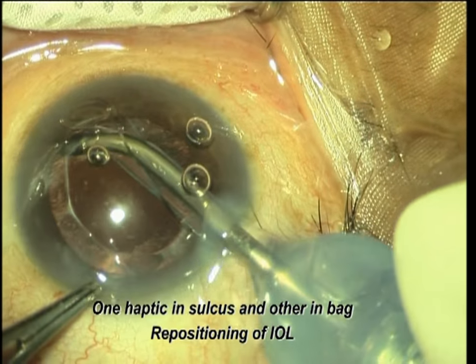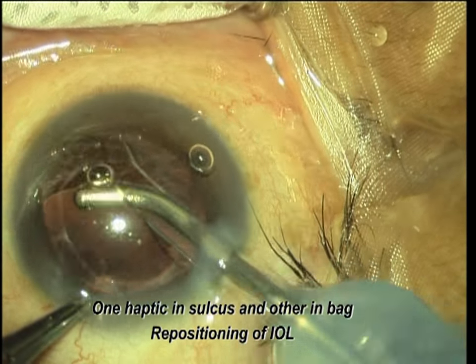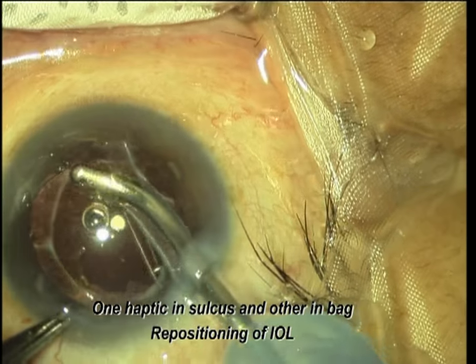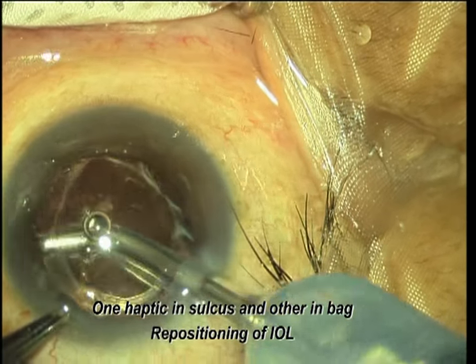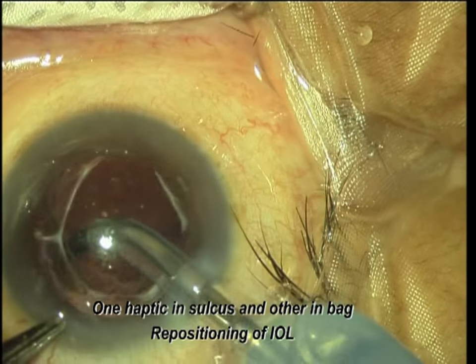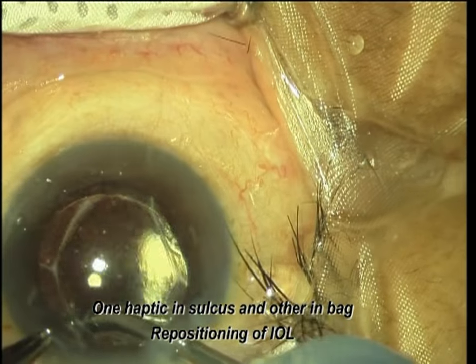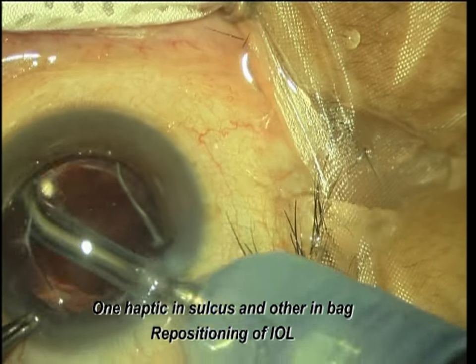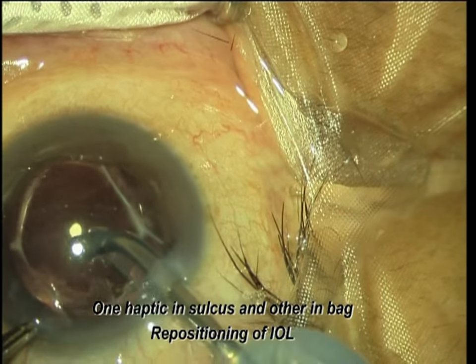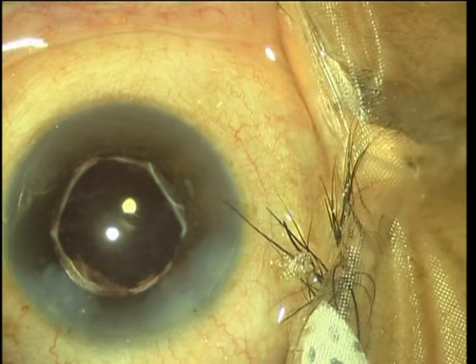That was causing decentration and astigmatic error. The rhexis seems to be broken. Again, we have to polish the capsule, open the bag, and gently slide the haptic into the bag with slight pressure over the haptic, then polish the anterior capsule as much as we can to avoid the chances of PCO later on.